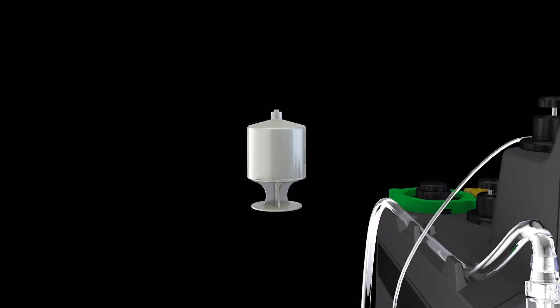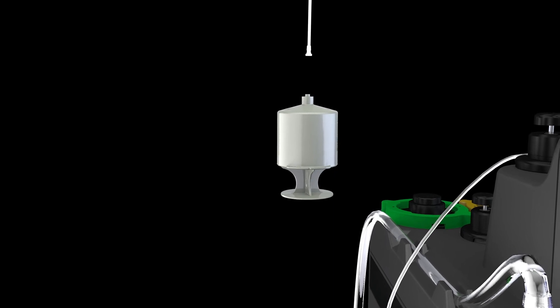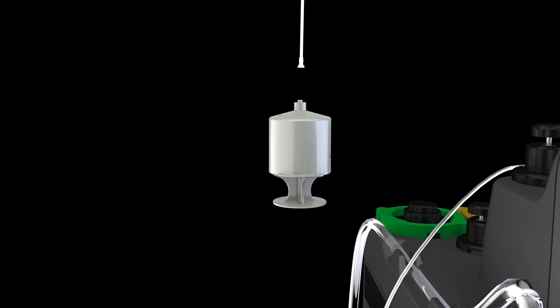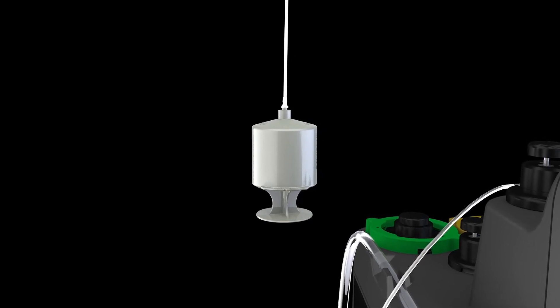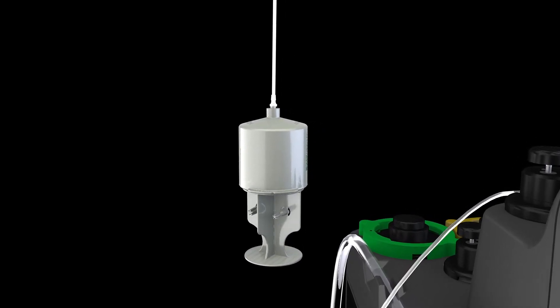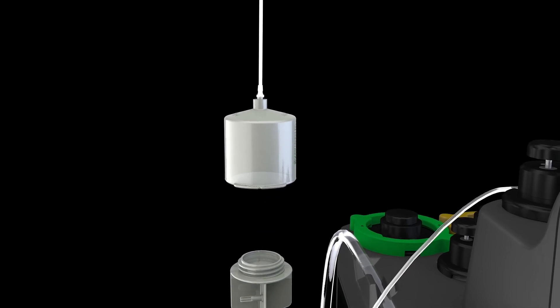Pick up green stopcock additive delivery line, remove cap, and attach standard lure fitting to additive cartridge. In a counter-clockwise motion, unscrew and remove plunger end of the cartridge and set plunger aside.